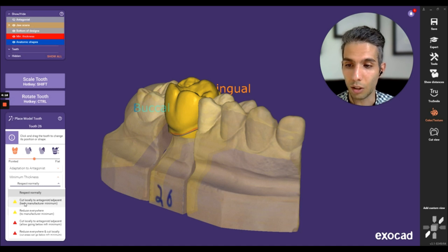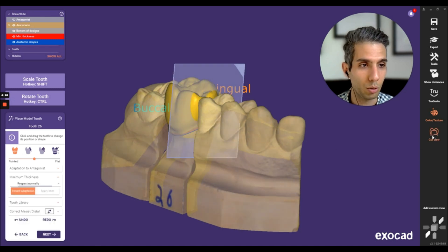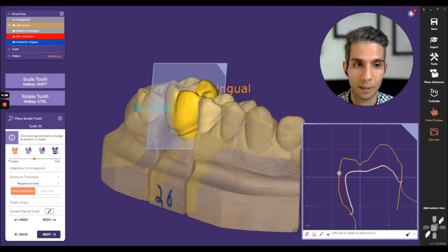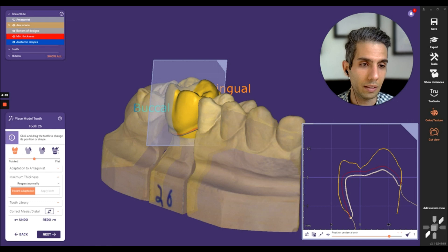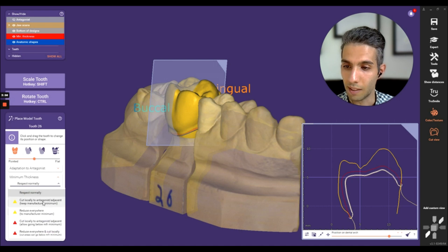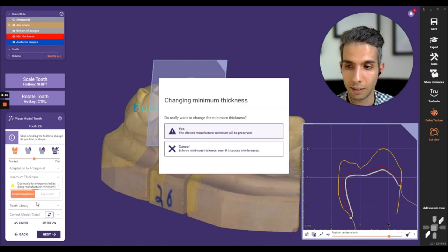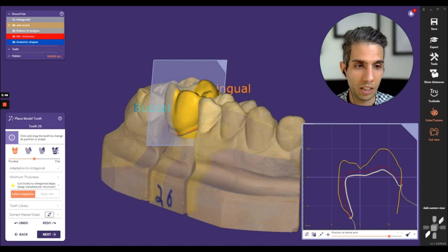The first one with the yellow triangle is 'Cut Locally to Antagonist/Adjacent.' I'm going to enable the cut view here to know exactly what we are doing. As you can see on the right side in the cut view, the red line here is the minimum thickness of the crown.